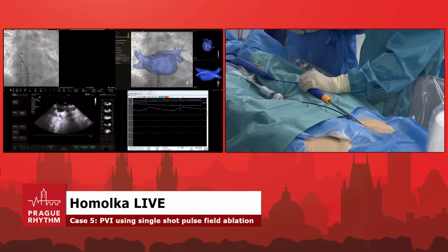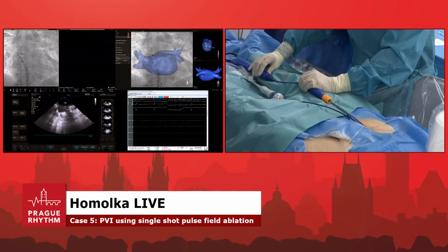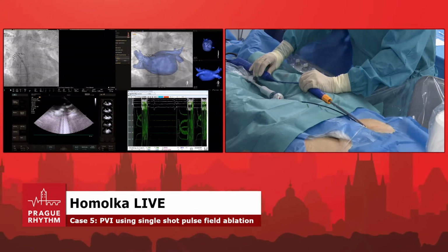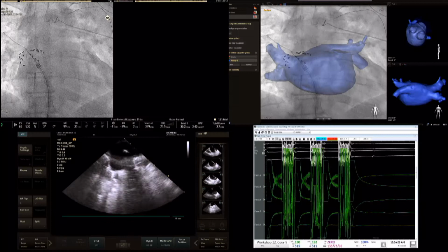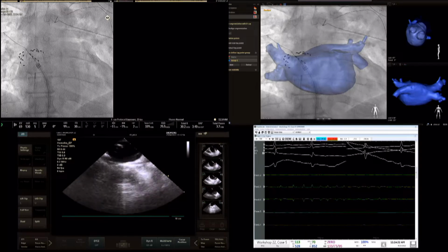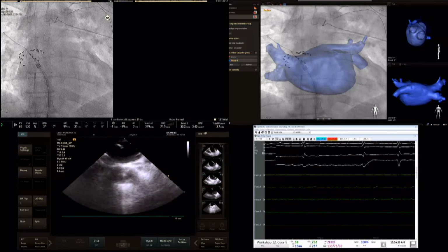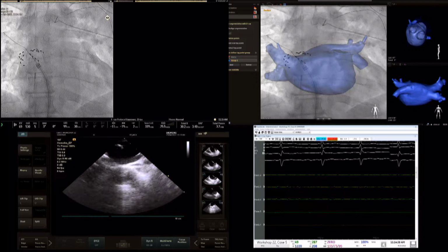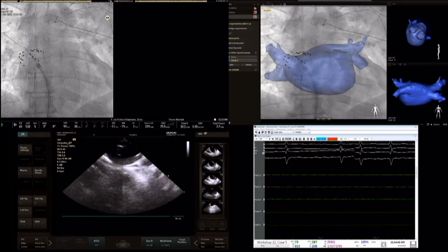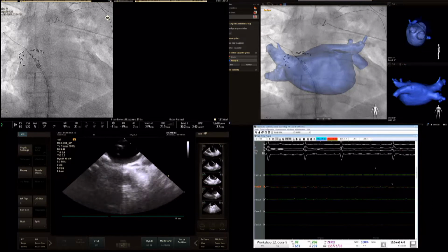If somebody has a question, you're welcome to. I don't have a question asked here, but maybe a recommendation. Next time when you do the case, please change the color of the intracardiac recordings to yellow or something which is visible, because this green is almost invisible. Can you make it like bright? Light color on Pruka. People cannot see the disappearance of the signals. No, I hate this green. Okay, fine, you are right.